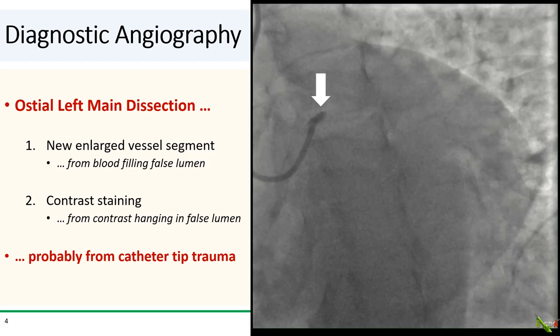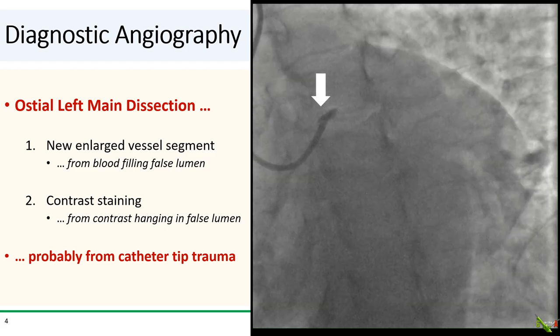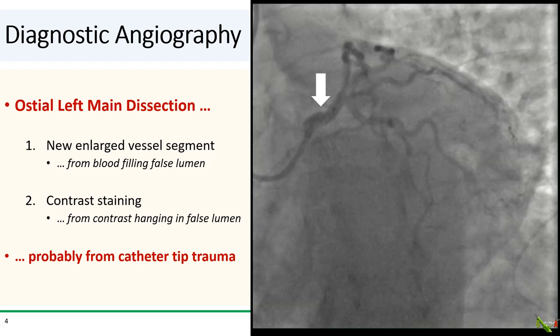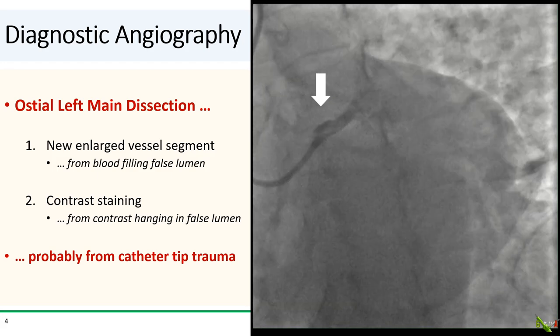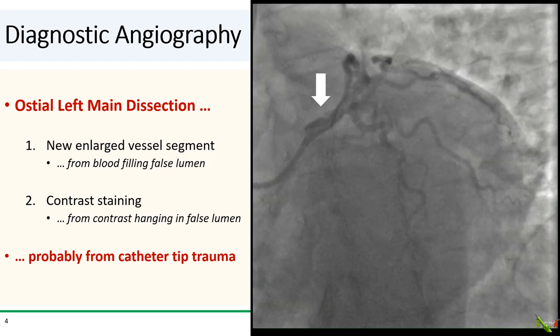We see a couple of classic features of coronary dissection. First, there is a new enlarged vessel segment which is due to the formation of a false lumen and blood filling into the false lumen. And second, we see contrast staining, which is due to contrast hanging out and swirling in that false lumen.